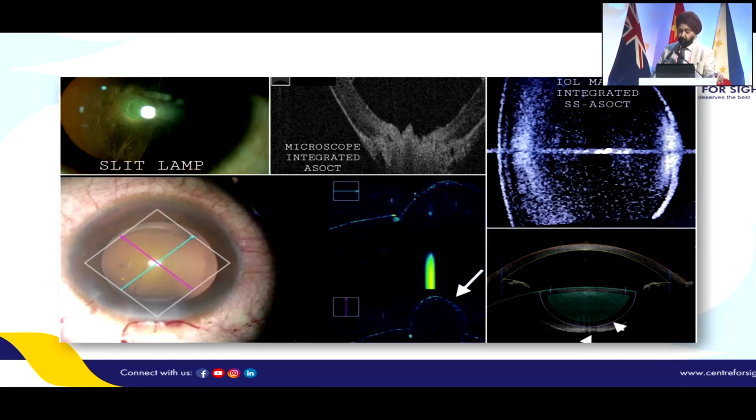So friends, this is the photo essay on the same. You could see a pre-existing posterior capsular defect on the slit lamp. You could see it when you were doing the femto. What you did was increase the default, taking the nucleotomy up so that you leave behind a thick epinuclear plate which will not be disturbed till the very end of the procedure. Even with the IOL Master 700, you could see this defect. So slit lamp examination, pre-op OCT, and even the IOL Master 700 can let you know and caution you that there is a defect and you have to work accordingly.